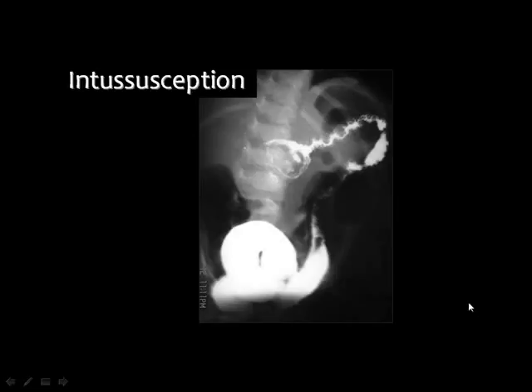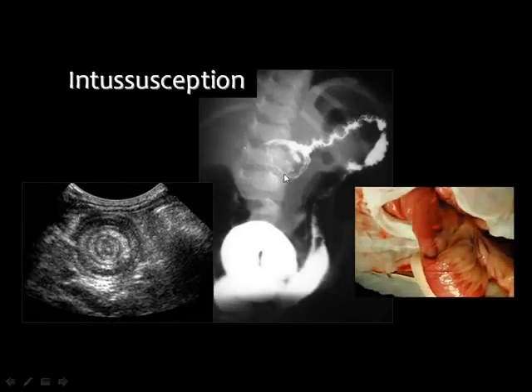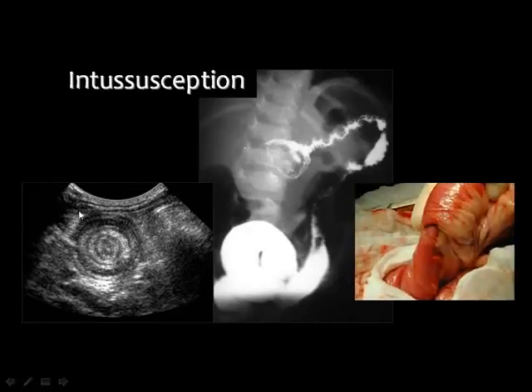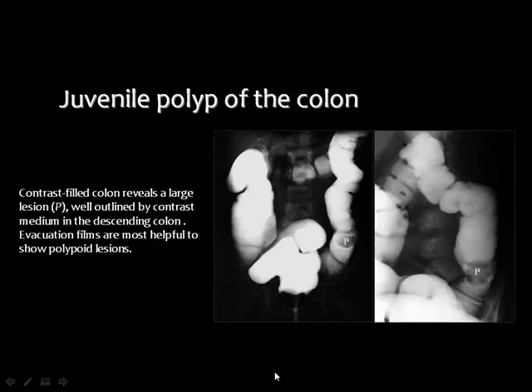And colonic intussusception is also one of the well-known diseases, and it will also be diagnosed by barium as well as by the ultrasound showing the classic presentation. And you know that barium can be used as a therapeutic maneuver to reduce this intussusception, and this is a trial for reduction of this intussusception.